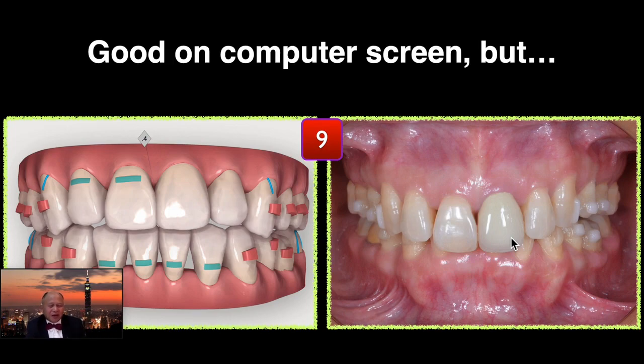And it's hard to get anterior intrusion if you intrude the posterior. You're supposed to intrude the anterior, but on the contrary, the patient intrudes the posterior, because that's the nature of this aligner. Because the aligner covers the occlusal surface, and the patient uses the chewies quite vigorously to chew on the posterior part. That's why you get the result like this.